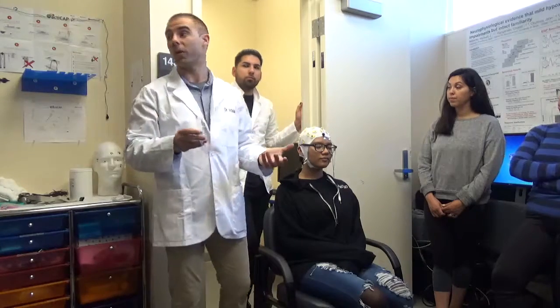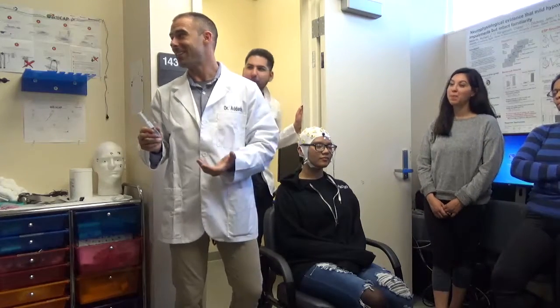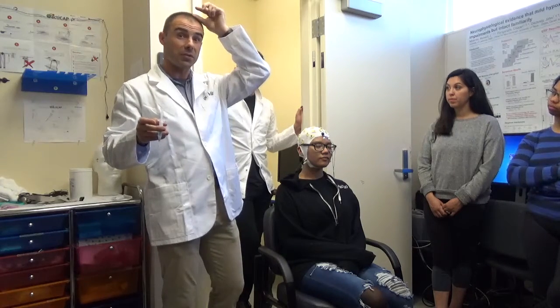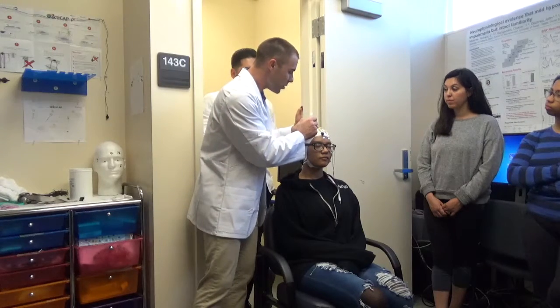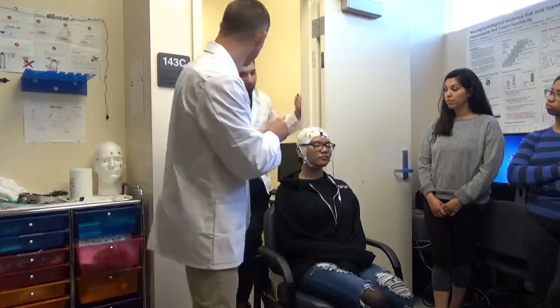Now, what can get in the way, Alex, my man, I don't know, dude, the dreads, it might not happen. So if you have guys who have dreadlocks or some sort of a weird hairdo where there's a physical barrier that keeps the electrodes off the side of the scalp, that can be a problem. But for the hair itself, you can come in here and lift up the capsule just a little bit, and move the hair out of the way and create a little channel. Okay? See that little channel in there?